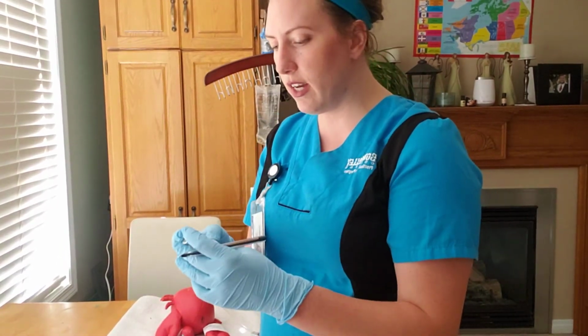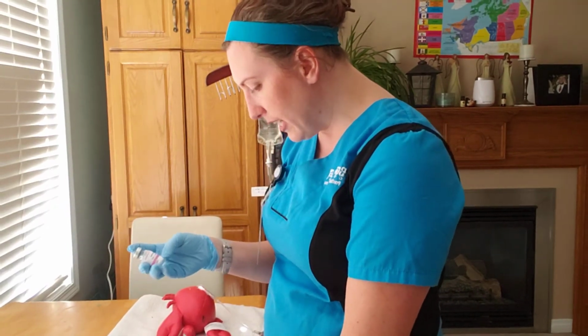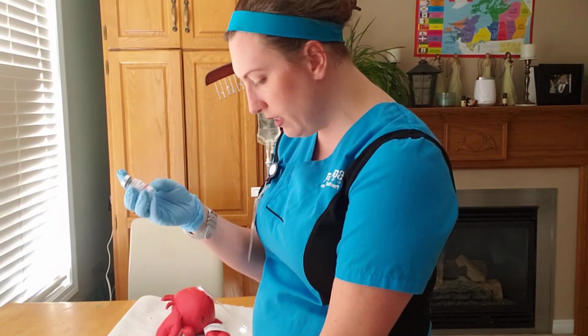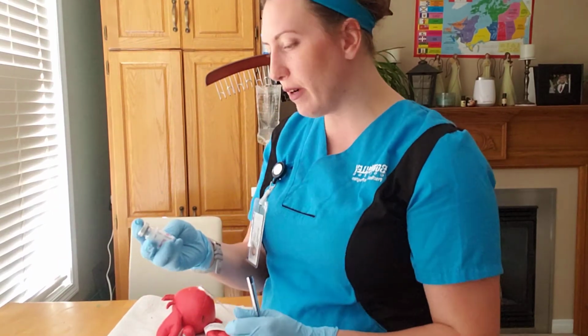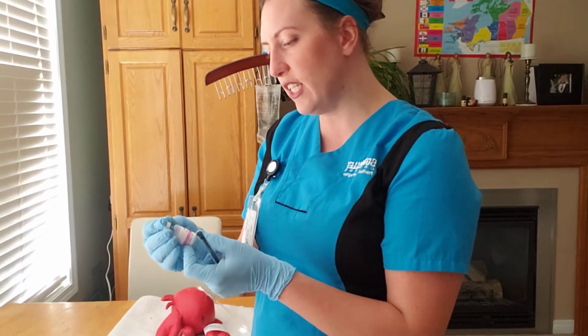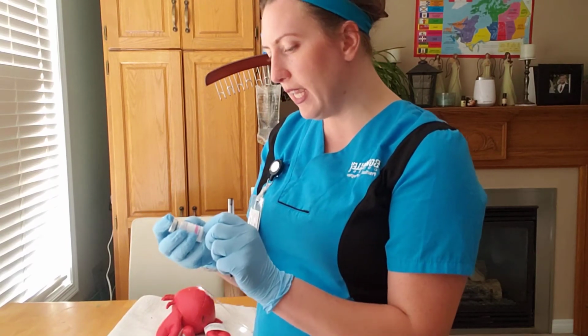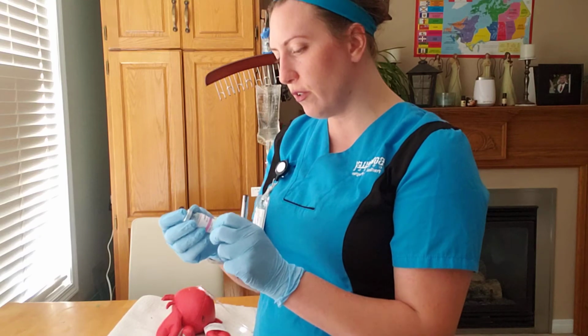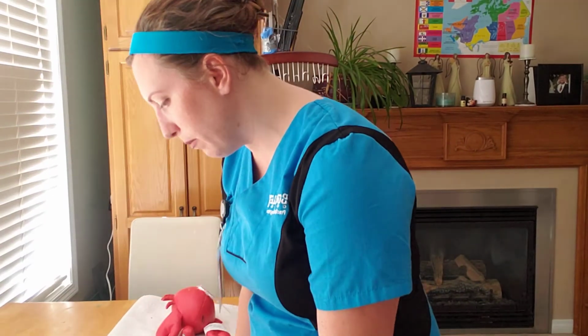Okay, so we've got ranitidine, 50 milligrams. We know we're gonna use 2 mils. The expiry is October 2023, so well within range. And this vial contains 2 mils. Okay, so we've got right medication, expiry, the right dose, the right route. All right, the vial compares to the MAR.